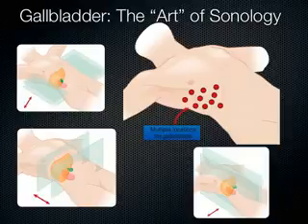I've found the gallbladder all over the place, and sometimes in older patients, everything kind of sags down. I can see it down here. I found the gallbladder over here before in an older lady. So, generally speaking, these are all the different locations you can dig around and find it.